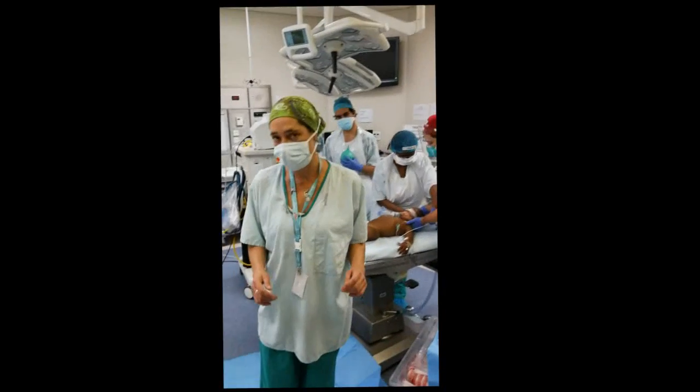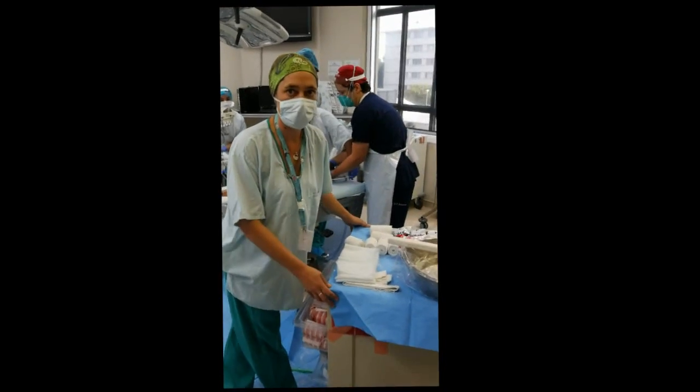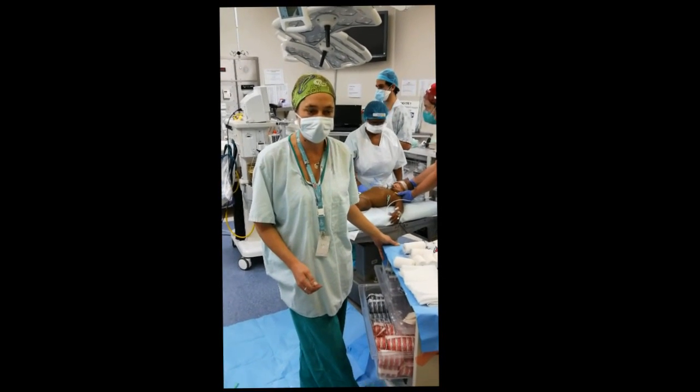This is the beginning of a demonstration on how to apply a spica cast. Spica casts are used for immobilization of femoral fractures, as well as following closed reductions and open reductions.